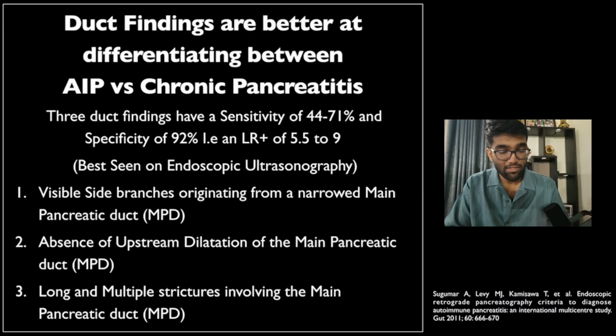Now, importantly, since this is based on endoscopic ultrasonography, it does not comment about the utility of the enhanced duct sign. But the enhanced duct sign, at least on face value, has high specificity, although this has not been formally verified. However, again, in the absence of an alternate explanation, for example, a neoplasm of the pancreas, diffuse uniform enhancement along the wall of the main pancreatic duct is very specific.